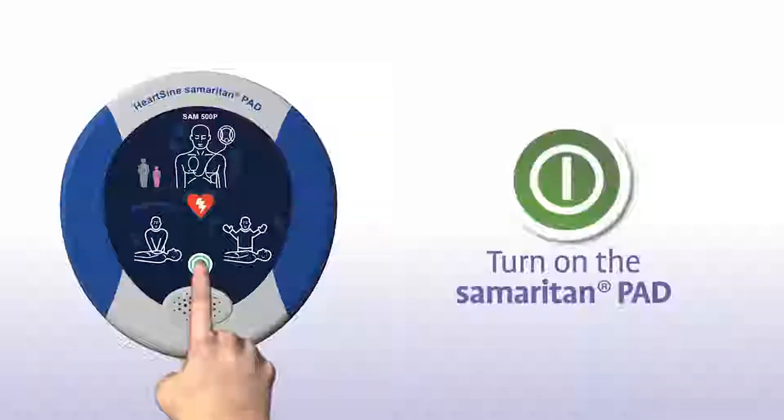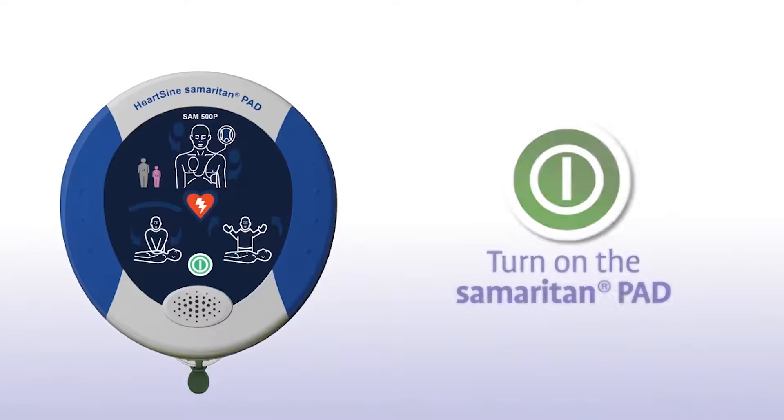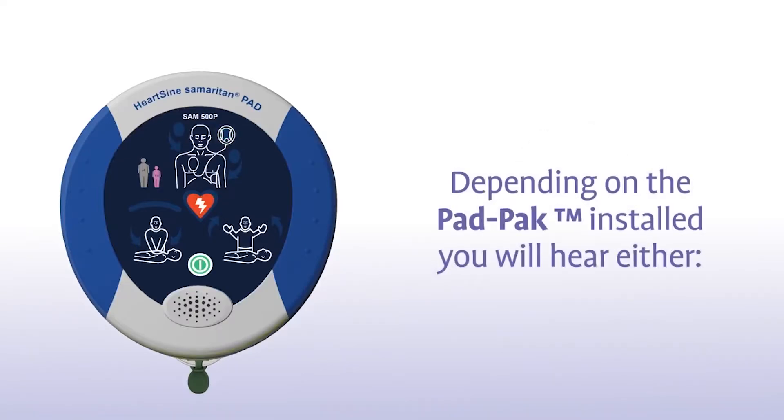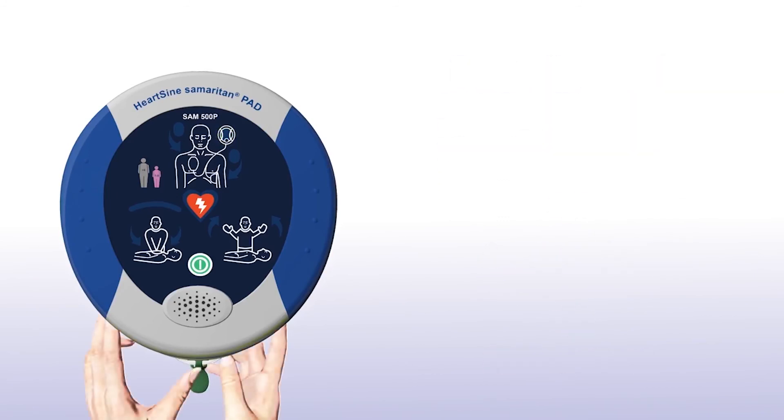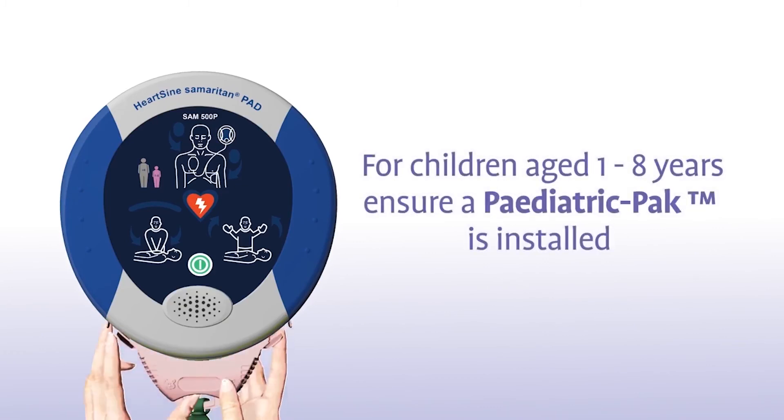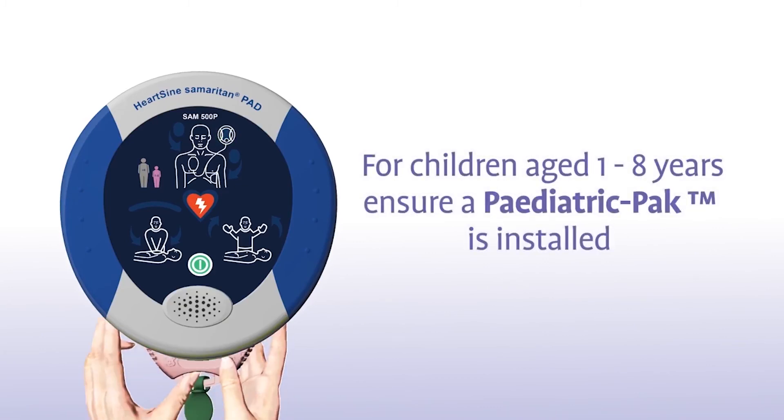Press the green on-off button to turn on the Samaritan PAD. Depending on the pad pack currently installed, you will either hear an adult patient or a child patient prompt. If the patient is a child between 1 and 8 years of age, you should ensure a pink paediatric pack is installed.